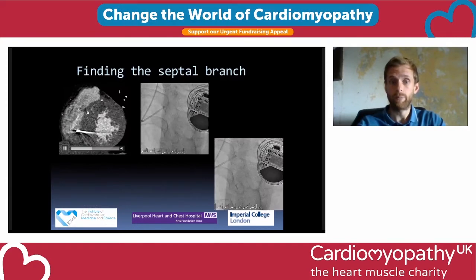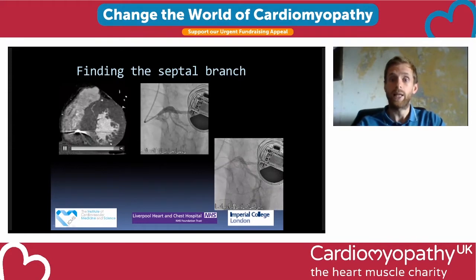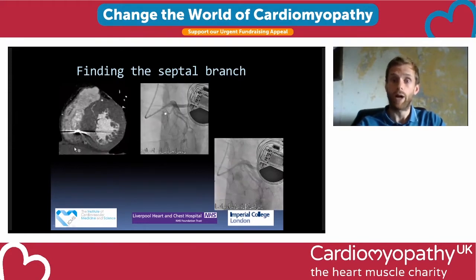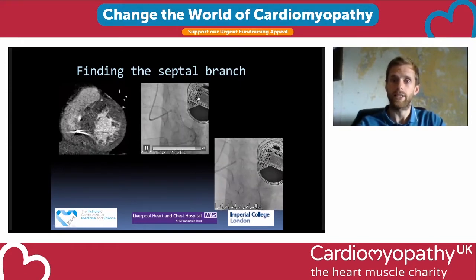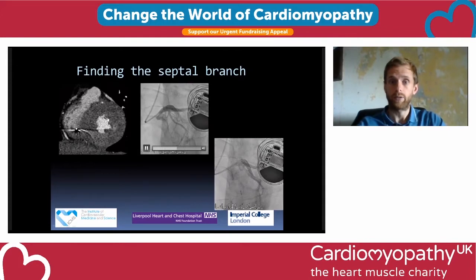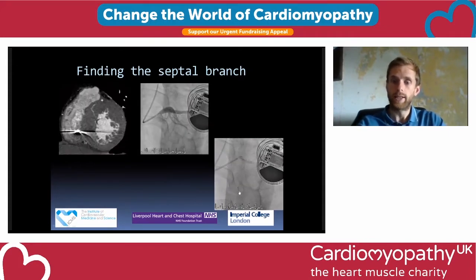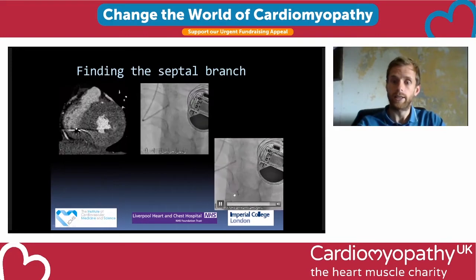So this is another example of the CT picture. This view shows that this piece underneath my cursor here is really thickened heart muscle, and here is the blood vessel going into it. Now we then recreate these same views with an angiogram in the lab. This is somebody's angiogram, so this is an X-ray picture. And we see that this blood vessel mimics this blood vessel, because it's the same blood vessel. We just looked at it with different methodologies. We then stick this balloon in the artery and deliver the alcohol beyond it.